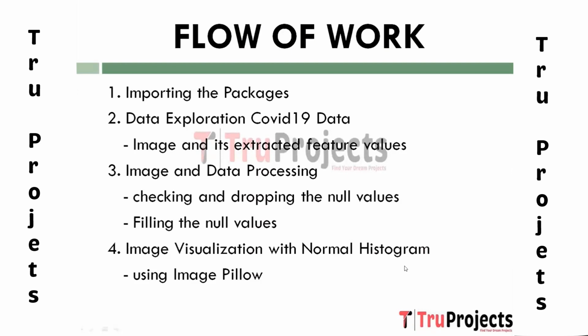Next, fourth, we have image visualization with normal histogram. In this we include using image Pillow, employing the Python imaging library, that is Pillow, to visualize images and create histograms to understand the distribution of pixel values in these images.